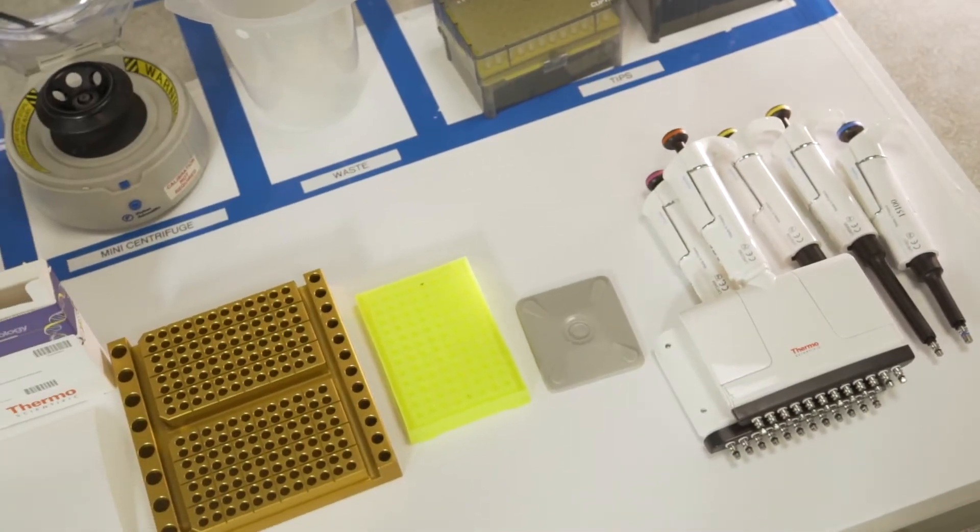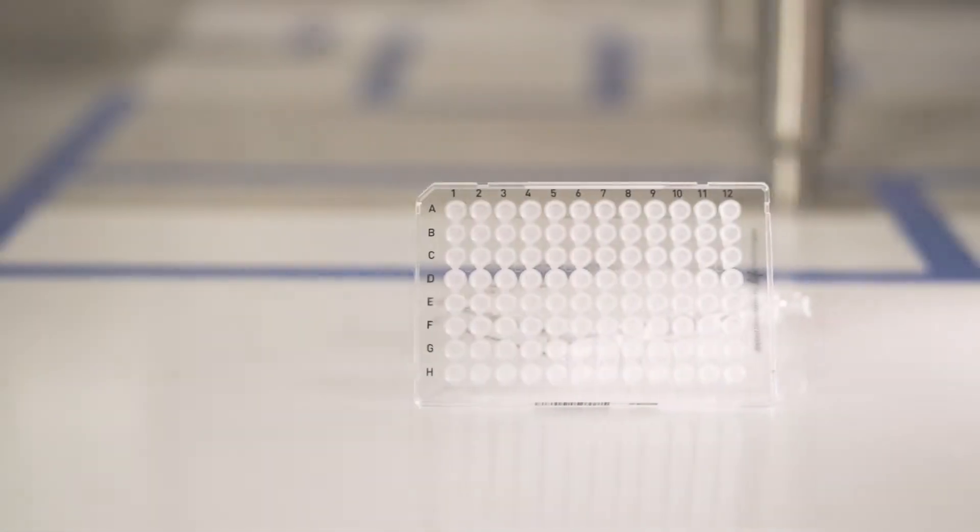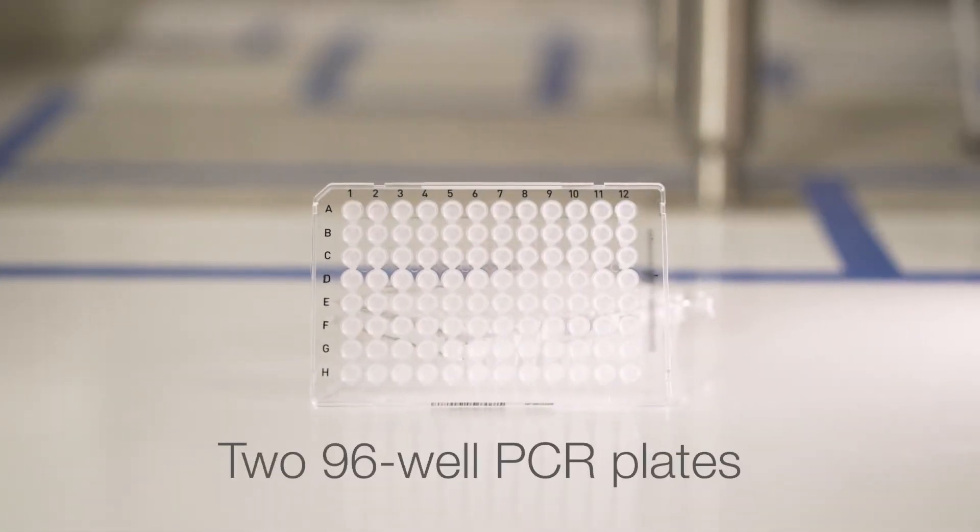You'll need the following items to run your assay: two 96-well PCR plates—one will only be used as a working plate.